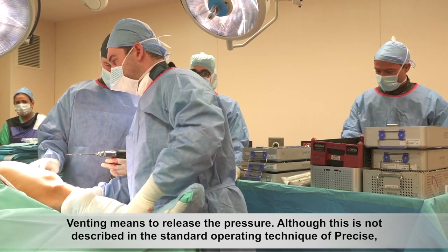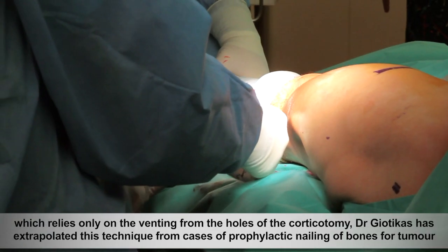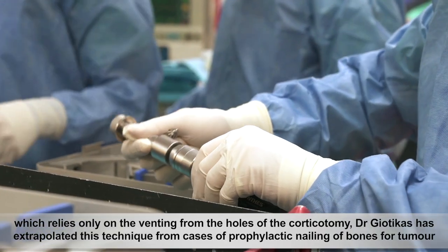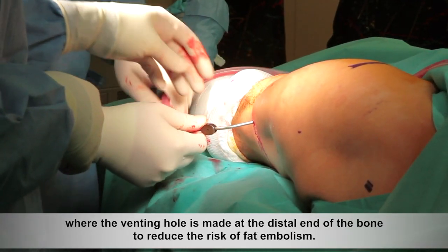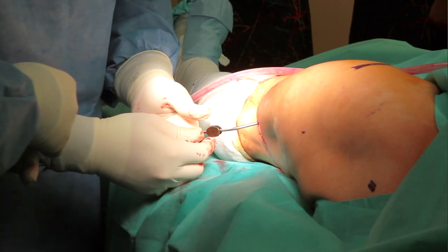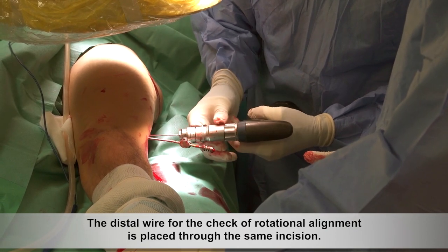Venting means to release the pressure. Although this is not described in the standard operating technique of Precice, which relies only on the venting from the holes of the corticotomy, Dr. Geotekas has extrapolated this technique from cases of prophylactic nailing of bones for tumor, where the venting hole is made at the distal end of the bone to reduce the risk of fat embolism. The distal wire for the check of rotational alignment is placed through the same incision.